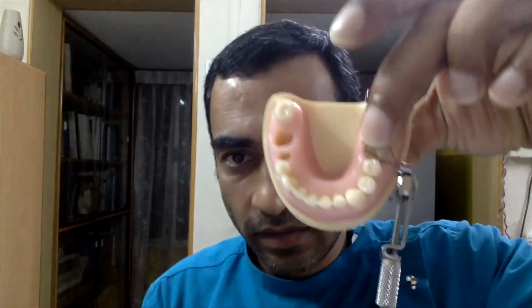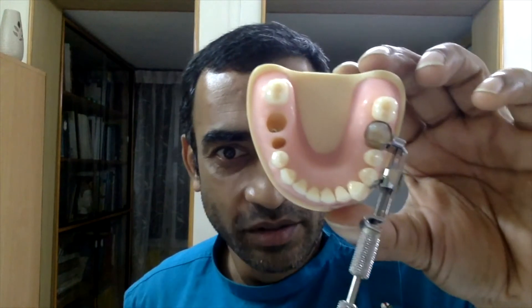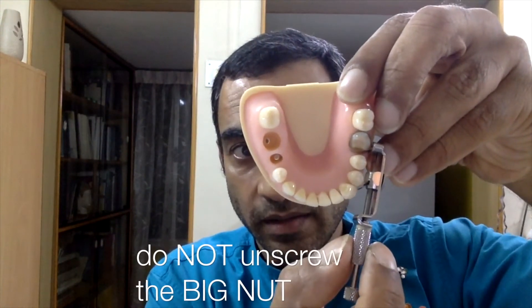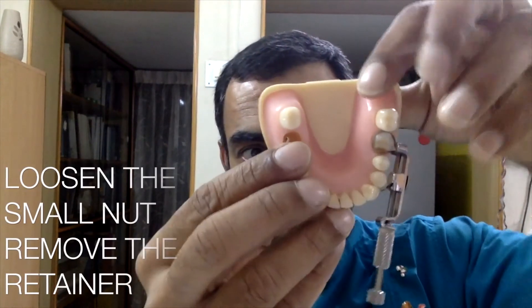After you've placed the band across the tooth, tighten the big nut. As you tighten the big nut, the band gets tighter and tighter around the tooth. After this you can place your wedge and go about doing your restoration. The last step, once you finish your restoration, is to remove the retainer — and the proper way is not to loosen the big nut, but to loosen the small nut first.